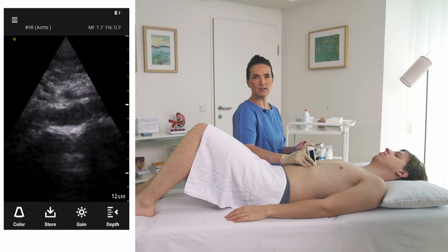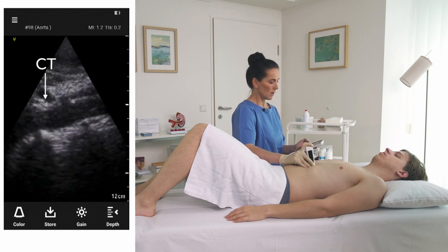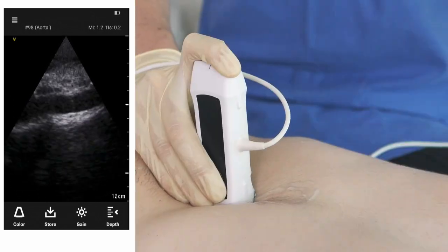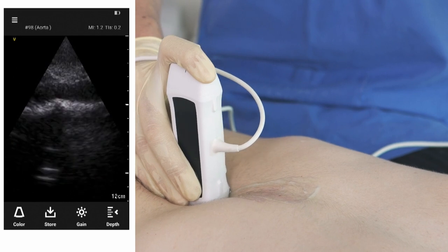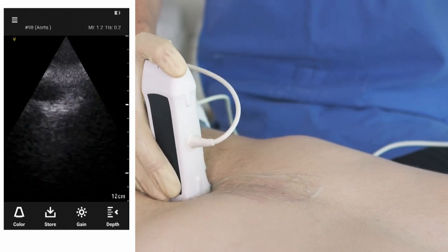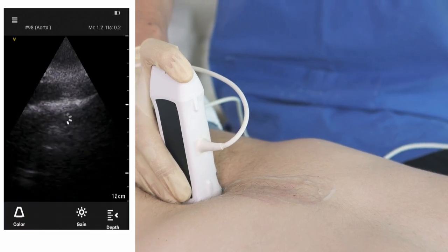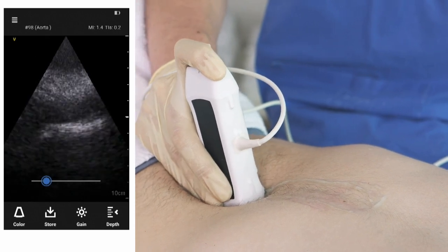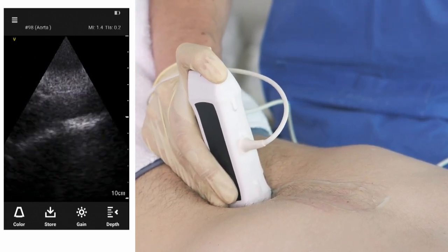The first vessel leaving the aorta is the celiac trunk, followed by the superior mesenteric artery. You can see a little bit of aorta close to the navel. You may want to reduce the depth here a little bit to see the aortic tube very clearly.